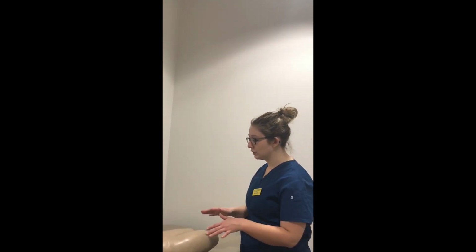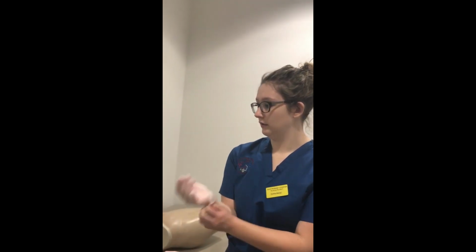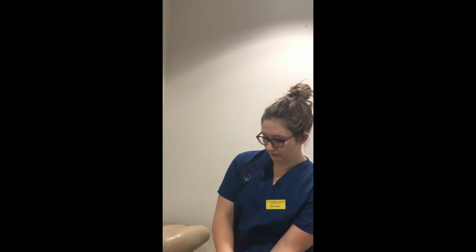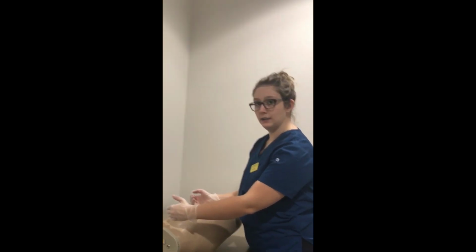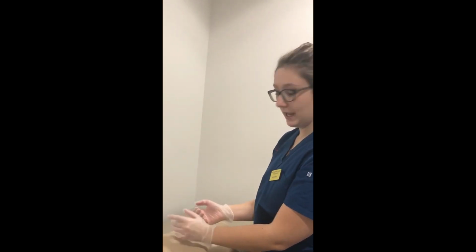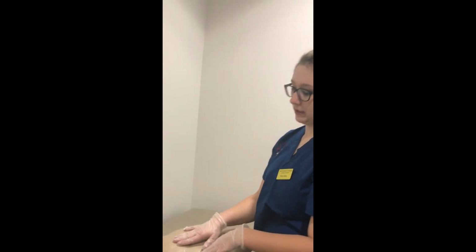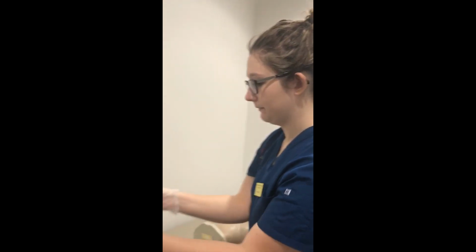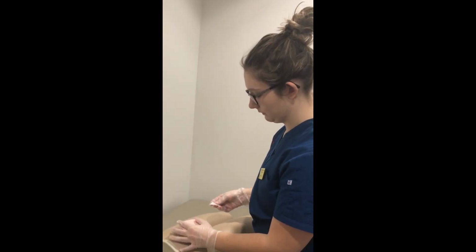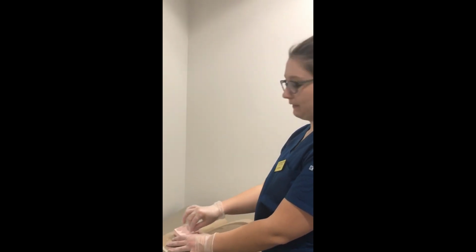I will explain to them what medication I will be giving and that I will be giving it in the abdomen. So for landmarking, I'm going to put my gloves on first. And then for the injection, you want to give it above the iliac crest and below the umbilicus about 2 inches, and then either to the left or the right. So for this injection, I will be giving it to the right. So I will clean the area off with an alcohol swab, starting in the middle, working my way out for about 3 to 5 seconds.